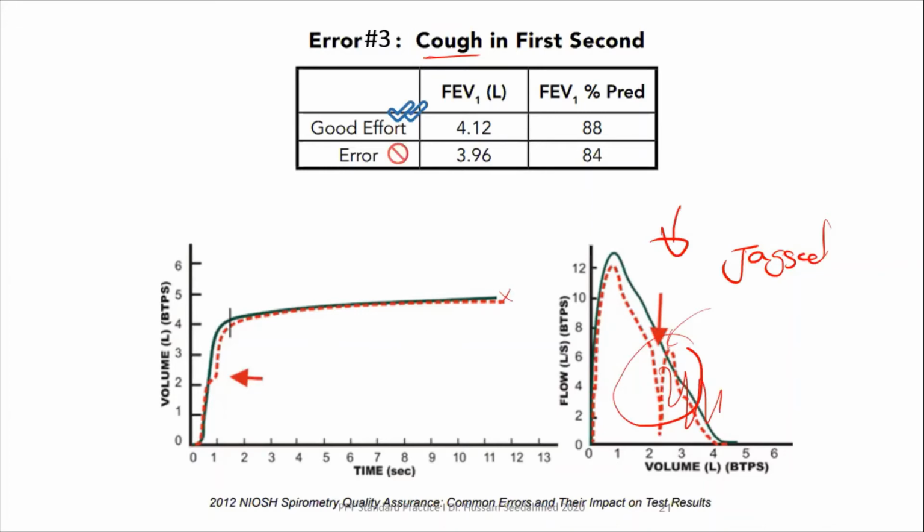Definitely it is hard to prevent cough. But one of the solutions is that you need to moisten the throat. That is why sometimes you may give the patient a cup of water to minimize the irritation. But in the end the cough is out of your hands. You cannot prevent the patient, or even the patient cannot prevent himself, from coughing.